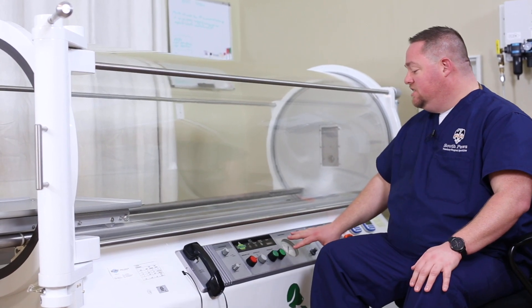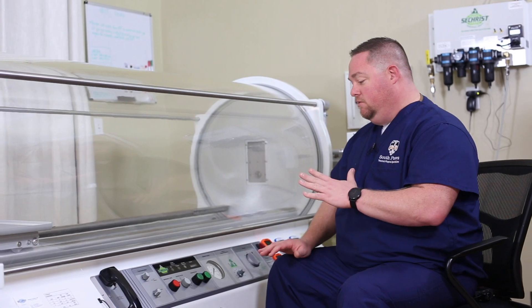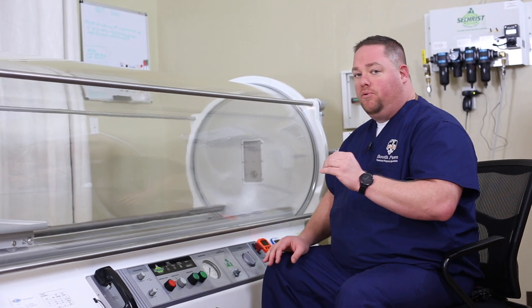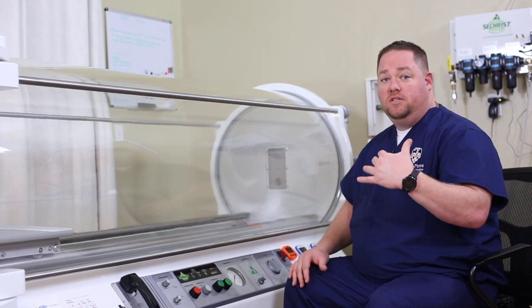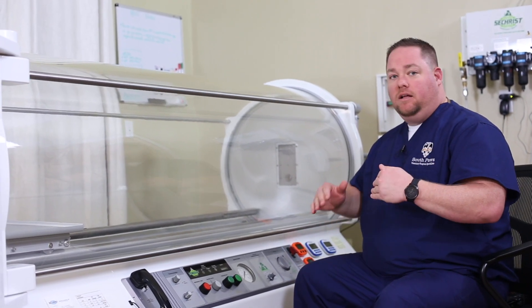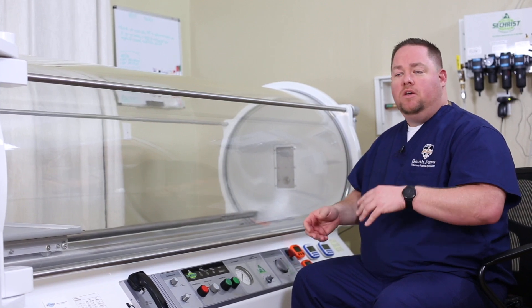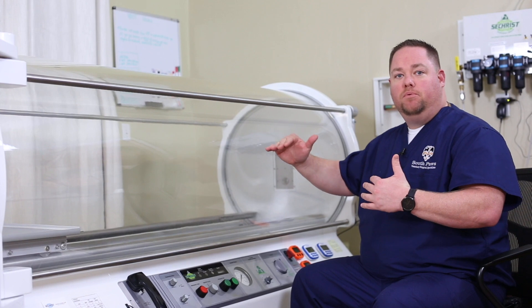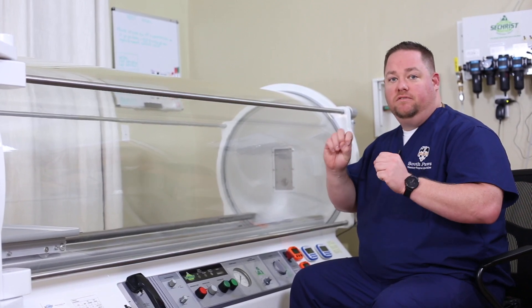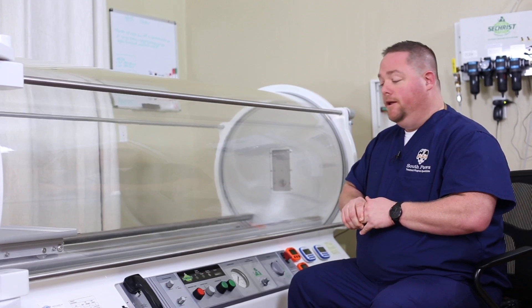In terms of the setup of the instruments and everything, it's all super easy. When you're pressuring up in this chamber, it's super safe and it will automatically increase the pressure at a set level at a safe rate. So you don't have to worry about making small increments as you're getting up to pressure in the chamber, which is really nice. You just set it and let it pressurize at that normal rate.